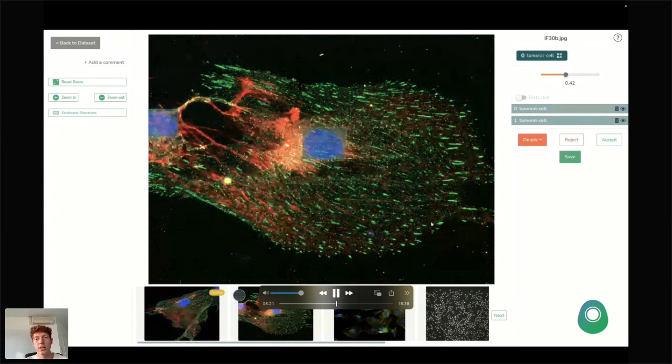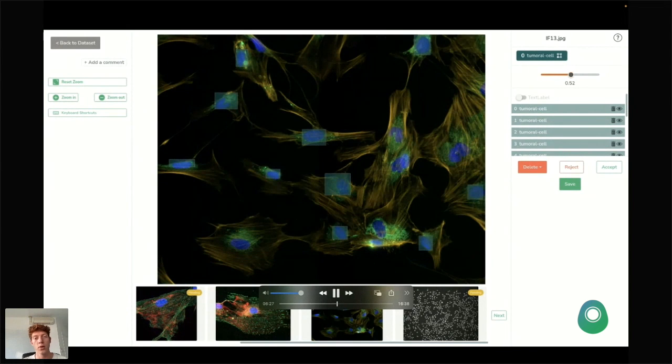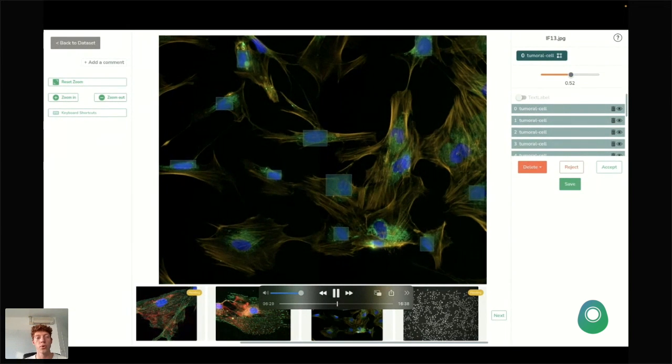This image is really easy. It has only 2 nuclei. This one is way trickier because it has a lot of small nuclei, and the model is kind of struggling on this data. So we will spend a bit more time to review these images, but it's really important to understand the importance, in fact, of the annotation, and they have to be as neat and as consistent as possible. So that's what we're trying to do here.